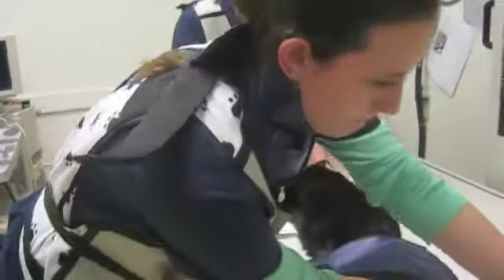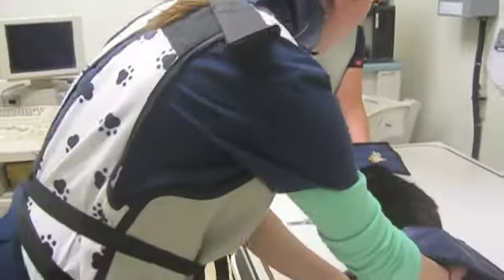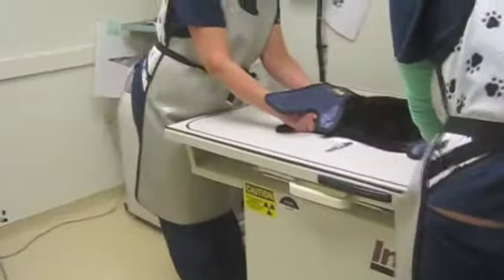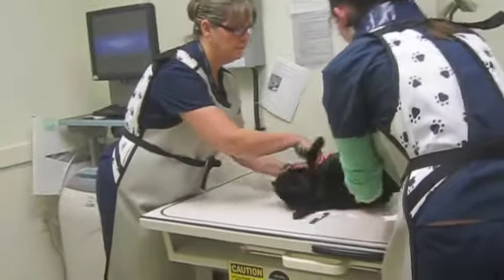Some contraindications of the GI contrast study would be if a patient is actively vomiting or regurgitating, if we know the patient has megaesophagus, if it is in a coma, and barium should not be used if a GI rupture is suspected. The study should end when the barium is in the colon.